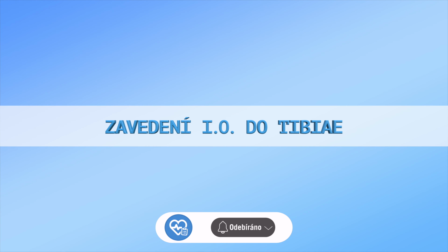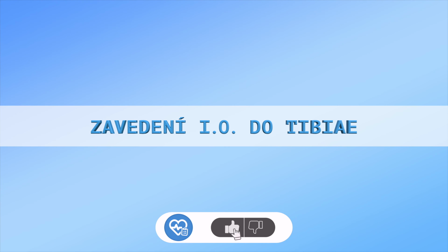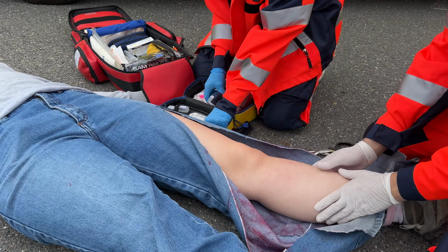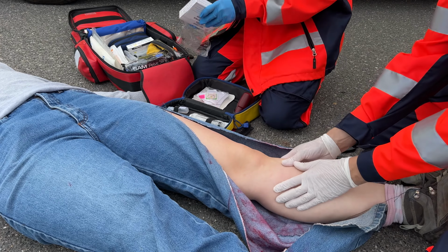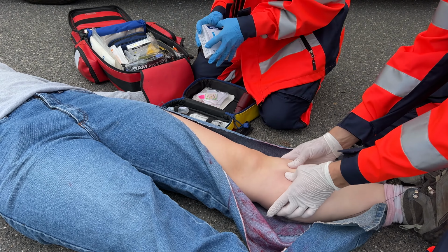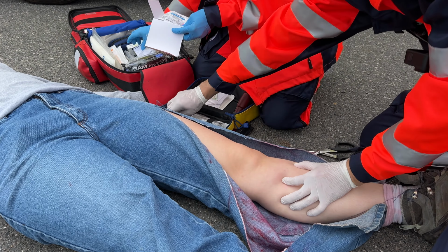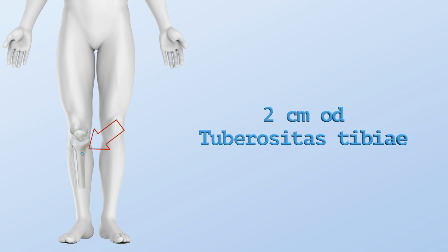Insertion of the intraosseous line into the tibia. The actual procedure demands adherence to the strictest sterile conditions. Before the procedure, it is necessary to prepare all tools, select an appropriate needle size for the specific patient, and attach the needle to the drill. Select and palpate the ideal site for insertion. When applying to the tibia, the site is about 2 centimeters medial to the tibial tuberosity.